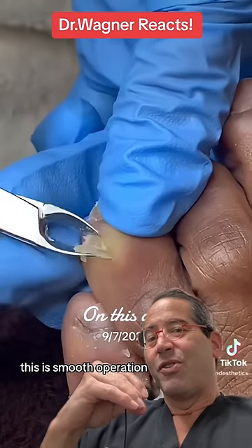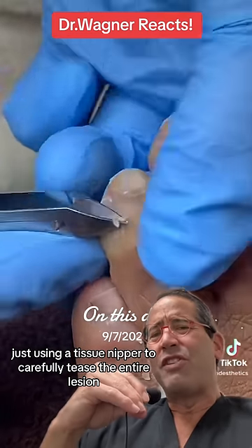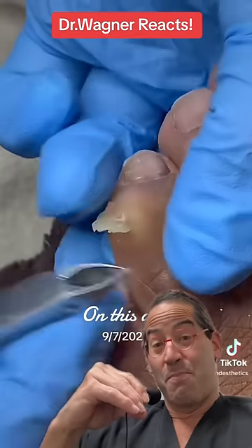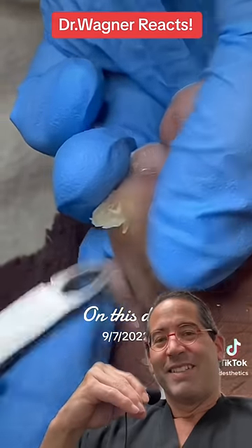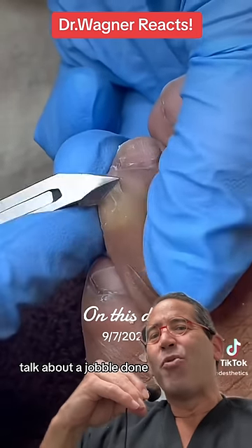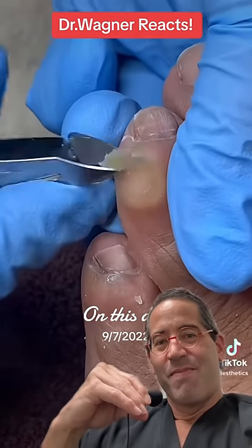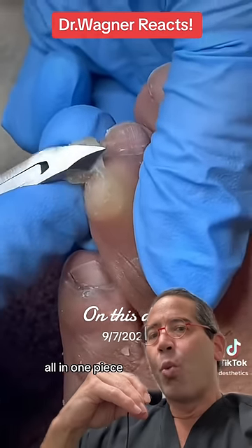This is smooth operation. Just using a tissue nipper to carefully tease the entire lesion. Talk about a job well done — all in one piece.